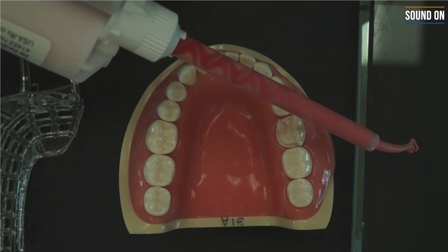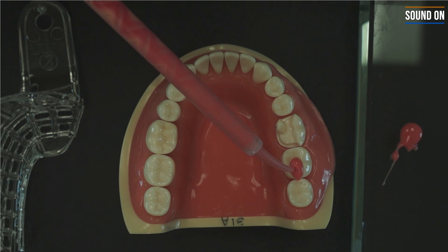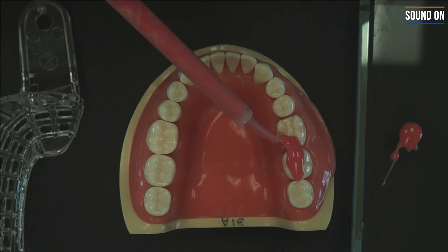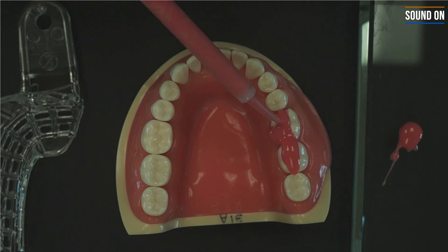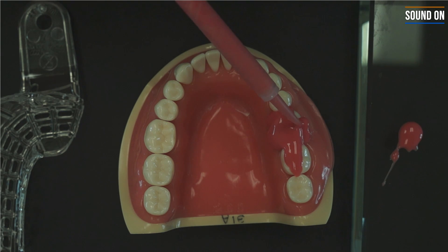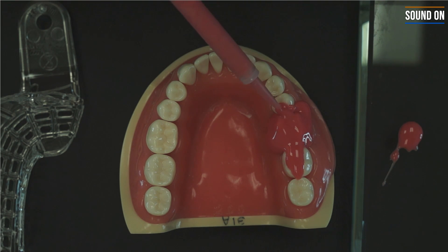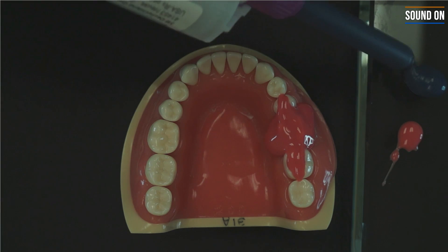You're going to start with the light material. Dispense the first part of the mixture because it's not well mixed. Start placing the material on the occlusal areas of the adjacent tooth, then move on with the mixing tip, always in contact with the prep. Try to avoid making air voids or air bubbles inside the impression. Make sure to cover all the area of the prep, including the buccal and lingual surfaces. Then move on to the premolars and remove the tip when you reach the premolars.